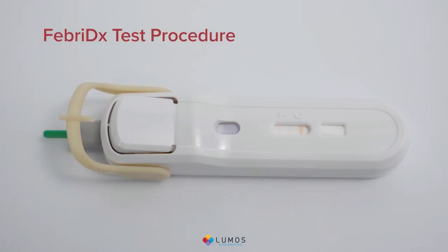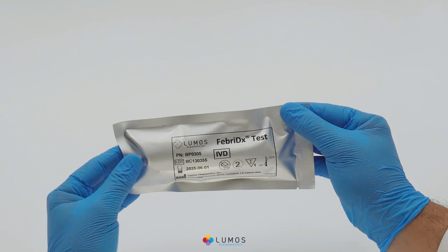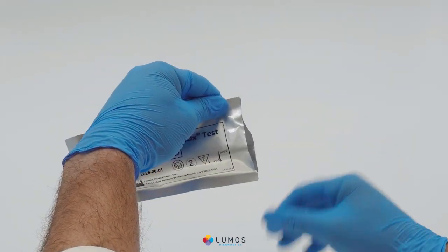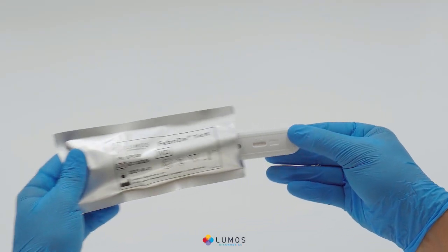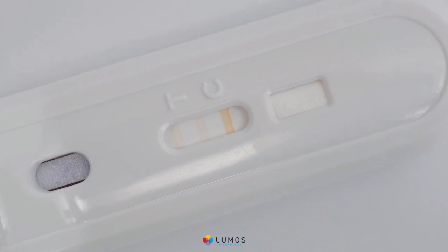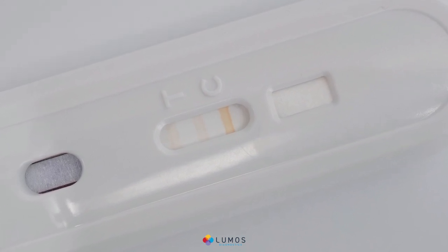Febridex test procedure. Select a Febridex test and check the expiry date on the foil pouch. Tear open the foil pouch and remove the device. An unused test device will show three faint orange lines in the result window.